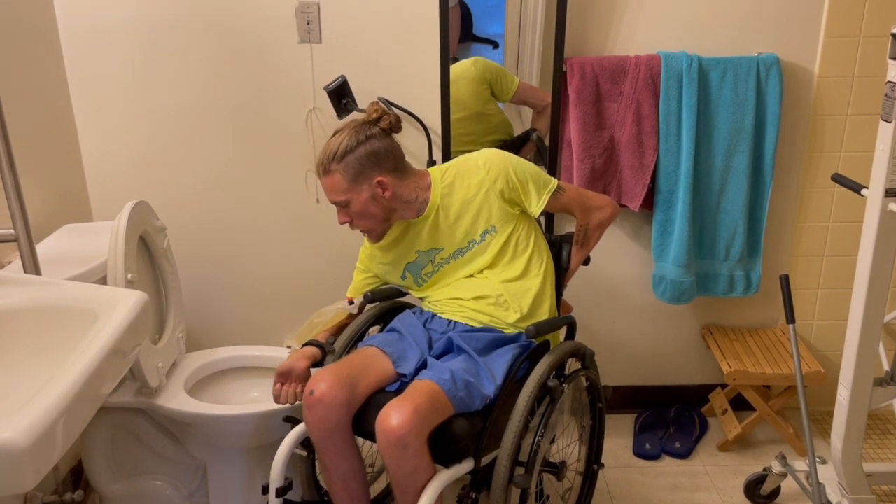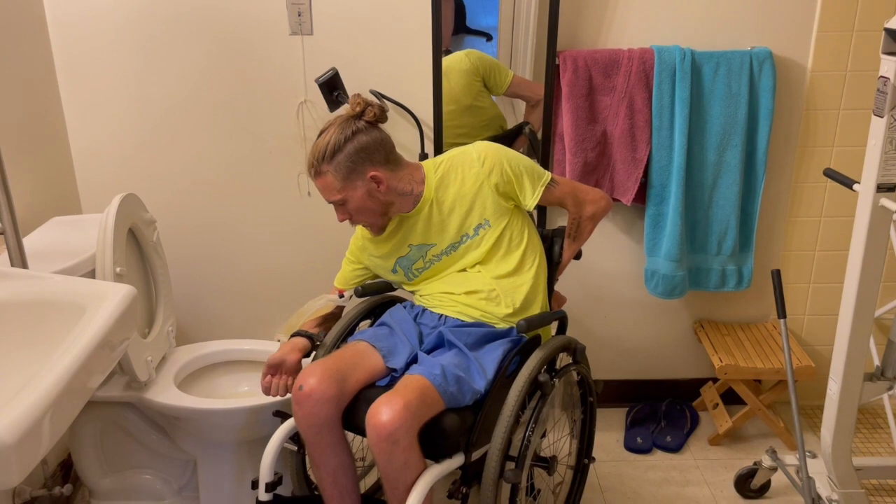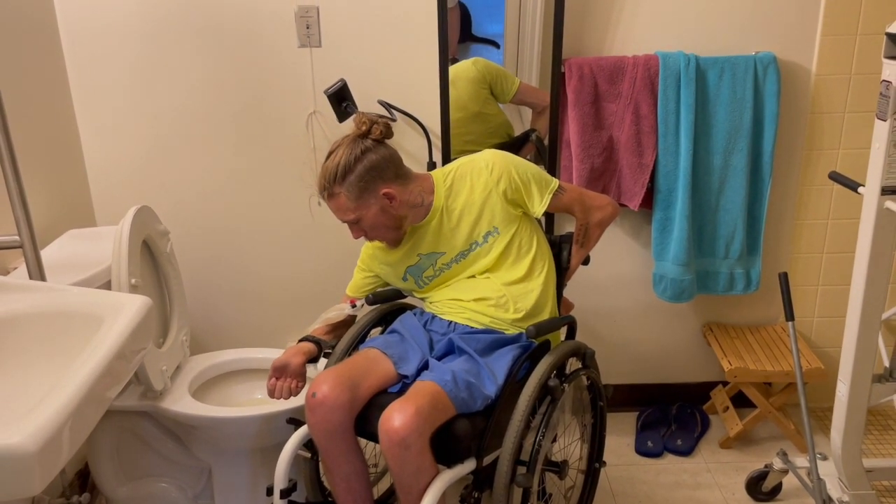It's kind of full now, so overflowing a bit. I usually don't let it fill up this much, but then I just use the crook of my arm to empty it.